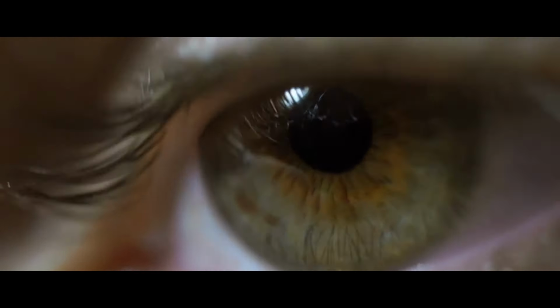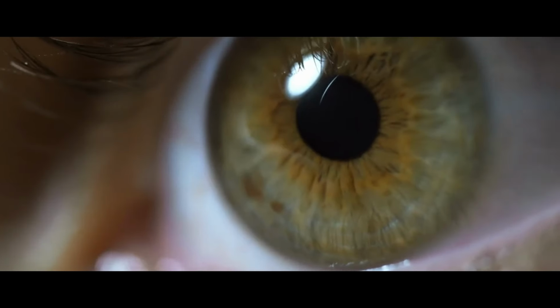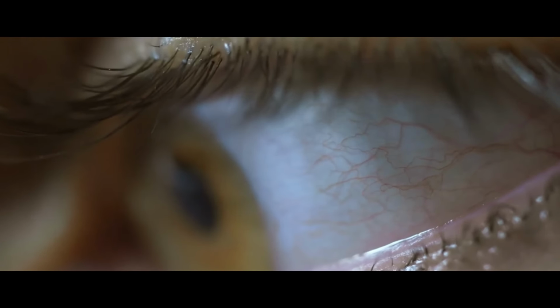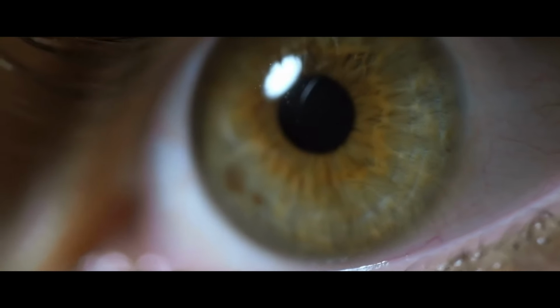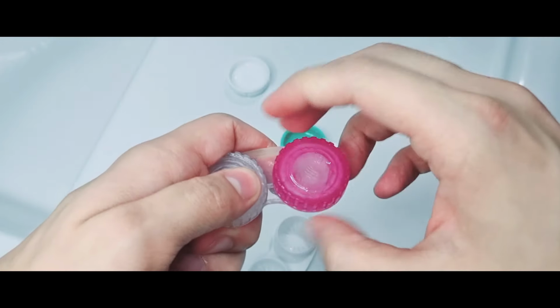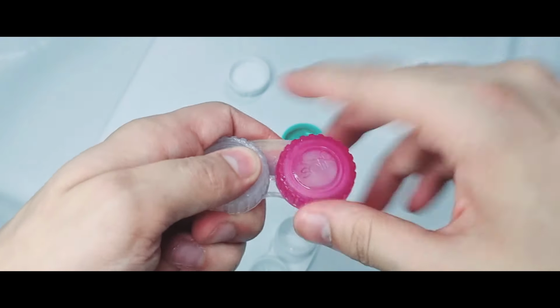I know there are so many contacts out there which say that you can sleep in them, but the best habit to do is to remove them and to let your eyes get refreshed for the next day. I think that is the best habit. I tried to sleep in my contacts, I think once or twice. It was a really bad decision. My eyes got really red, and I had pain in my eyes for almost 2 days or more, because I accidentally slept in the contacts. So if you're wearing any kind of contacts, just put them out in the solution in the night time.